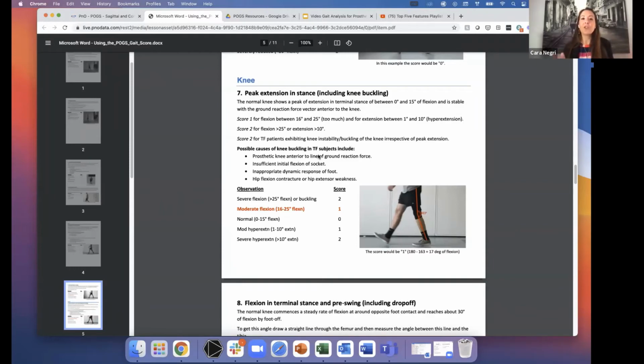If you're looking for a patient population to start with, I would always pick one patient population. So if you're more of an orthotics practice, you might want to say that you're going to start with all of your stroke patients that are coming to your clinic, just because then you can really look at the data in a way that says, okay, we've actually been able to decrease our patients' gait scores by an average of this.